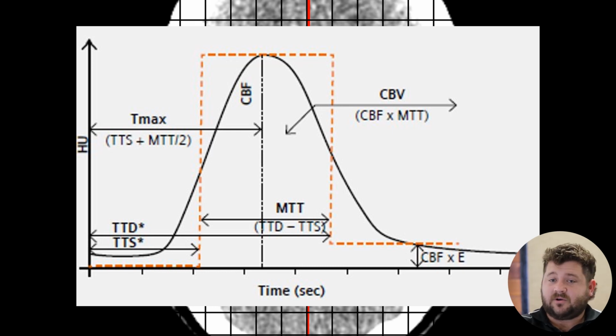So again, not all clots can go to endovascular clot retrieval. Some of them are too far into the brain for us to actually get to. And sometimes the core might outweigh our penumbra, so we might not have any penumbra. So it's already all dead tissue.